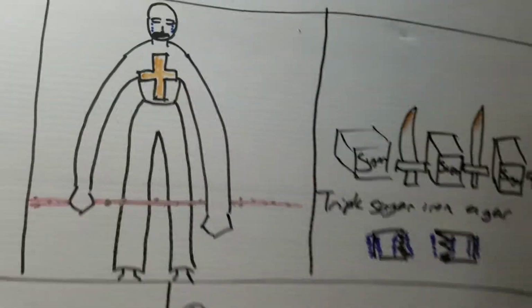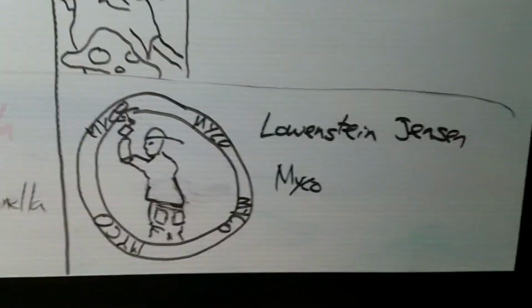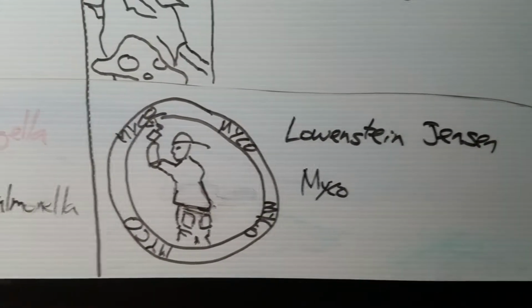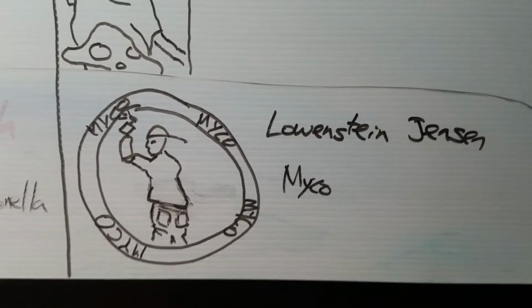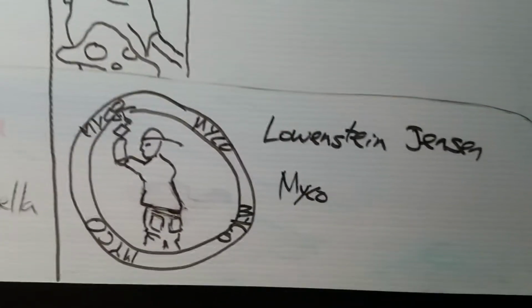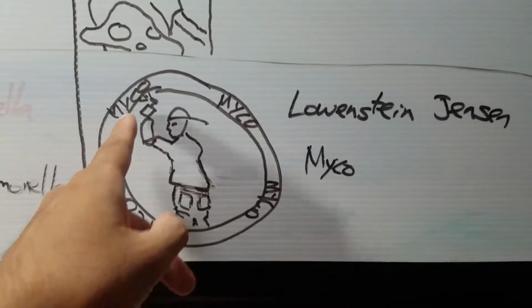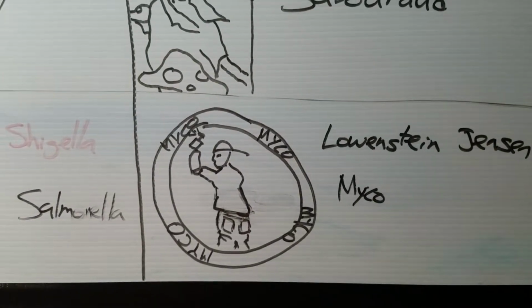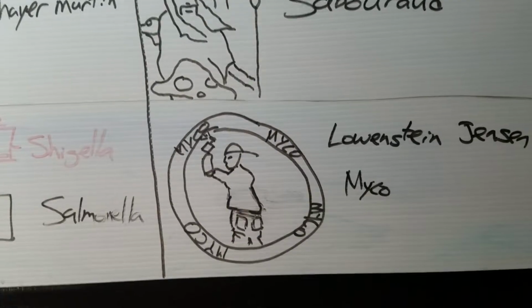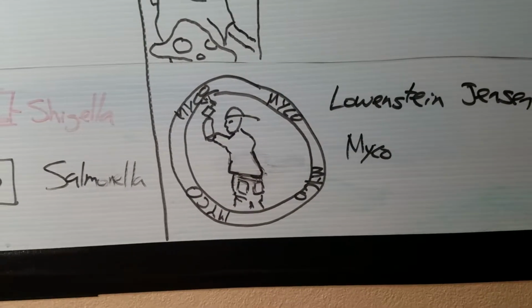Okay, we're almost done. I think we just have 3 more, so let's get it done. Lowenstein-Jensen. A lot of old people, they always like to say, those kids today, why they always got their jeans low, right? Low jeans. Lowenstein-Jensen, I remember low jeans. And what you can remember is that there's this guy over here, and if you even think about it, a lot of these kids who are wearing low jeans, they may be in the graffiti culture, they may be into hip-hop, or they may be ravers, right? Usually into that type of thing.